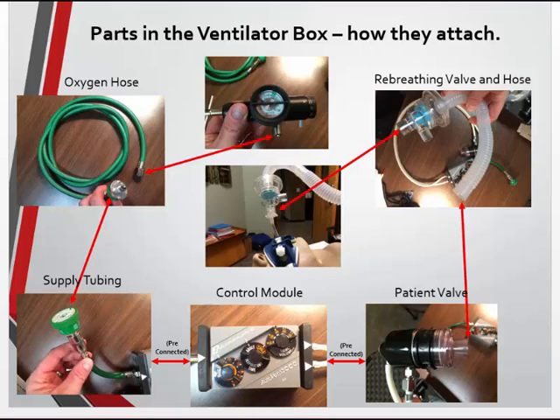There is a side port on this. We don't carry equipment to use this, but you can put a filter on there, or you can also put a PEEP valve on there if the patient requires PEEP for long term. Again, a long distance transfer that requires PEEP, we're either going to need to get one of these from the hospital, or they're going to have to get a ventilator that has a PEEP setting on it. Our ventilators do not have a PEEP setting. It's a valve, and we don't carry them.